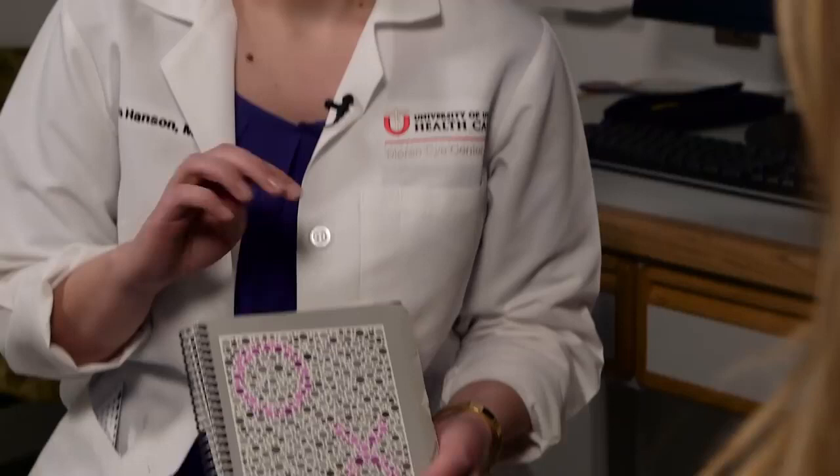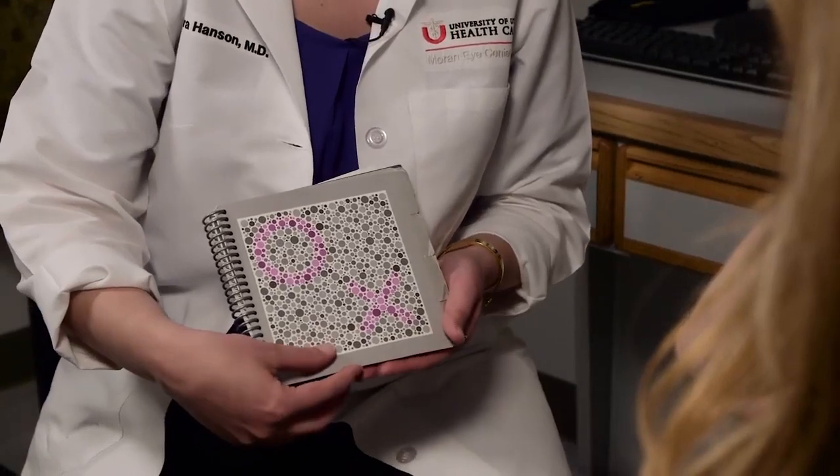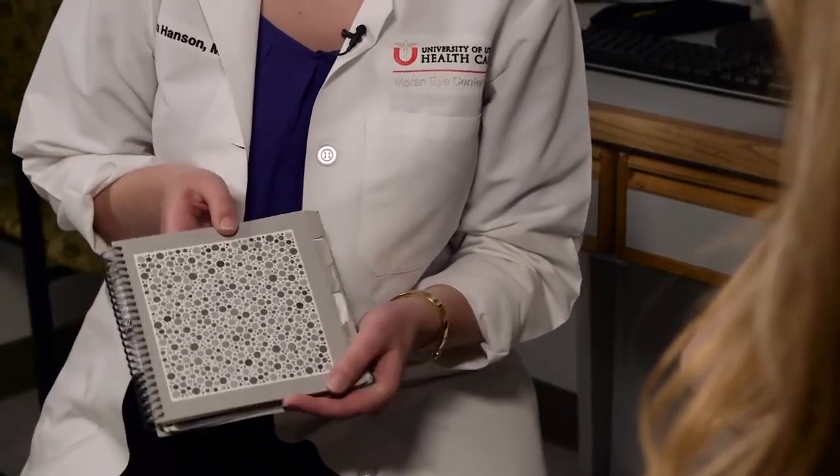The test starts out with 4 different control plates. So you want to have the patient test one eye at a time. We'll test your left eye first. So you ask the patient to describe what they see on the test plate. O, X. Good. So you go through all 4 of these. The 4th is a blank plate.